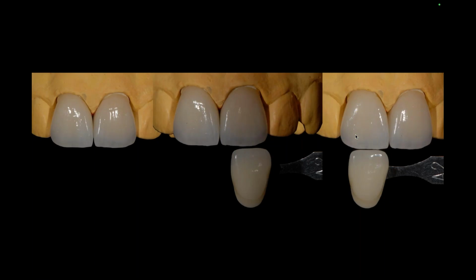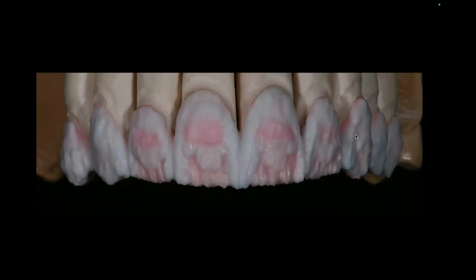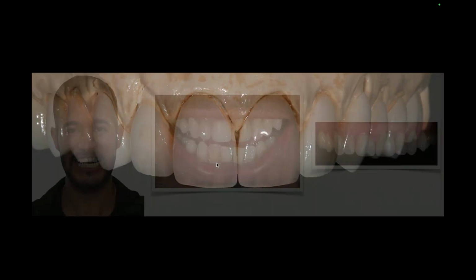So again, your knowledge of using those powders becomes really critical, and then how you filter them out with your enamel. All the powders that you use are about playing chess with them and knowing how to use them, and how I filter them with my translucent materials really adds into the final look of that to make sure they all work together.